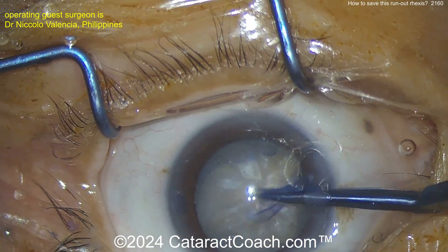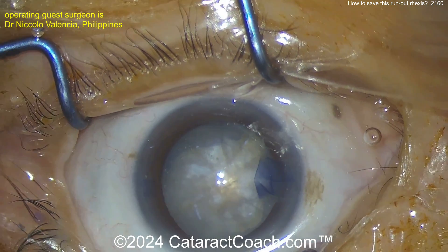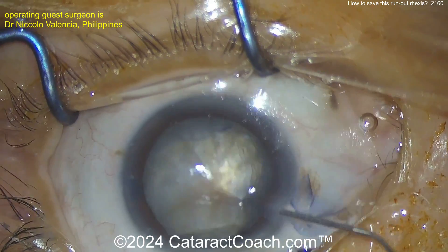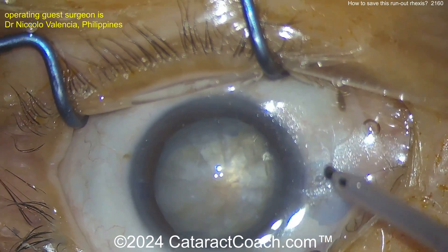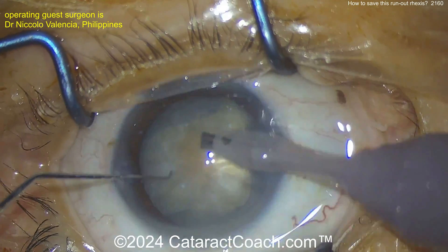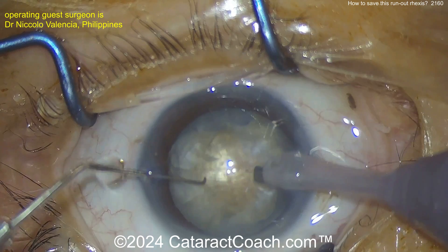It's looking like a bit of a hot mess here, a little bit tougher. Another cut with the scissors — so now we've got two areas to worry about. Let's see what we do with the phaco. Here comes the phaco probe into the eye.